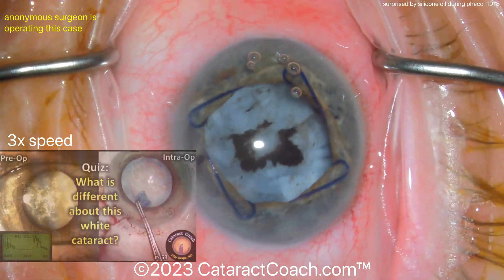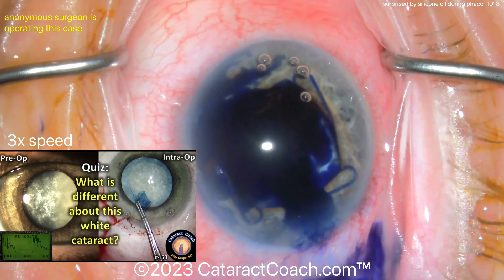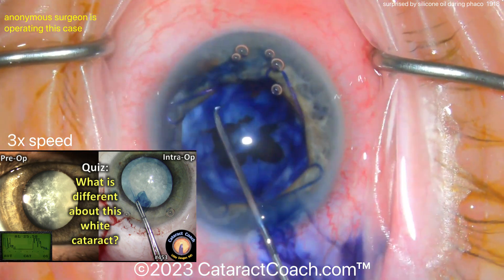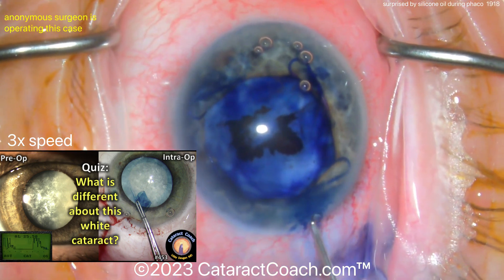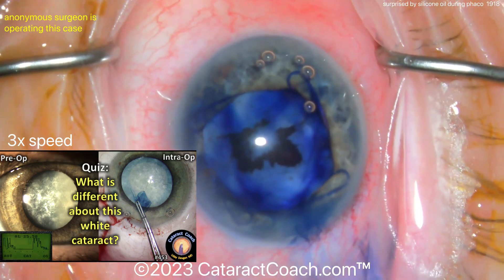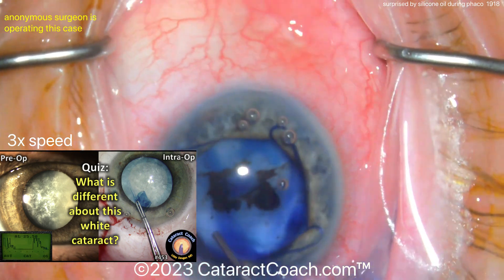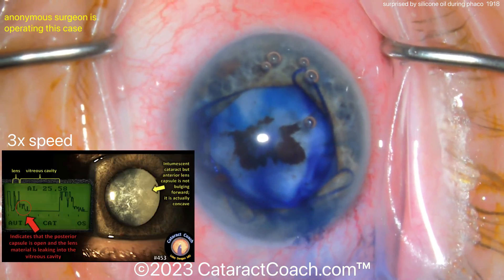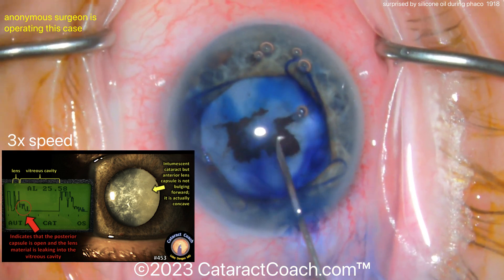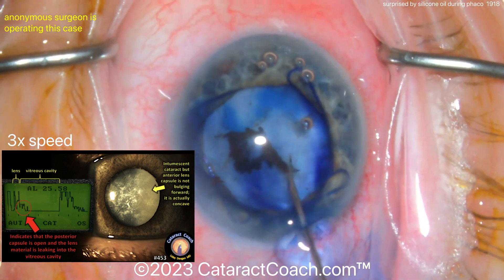Go back to old video number 453 from a few years ago. There was a quiz on what was different about this white cataract, and you can see the clue is on the A-scan — look at that inset picture. We'll put a link here. If you zoom in, you can see the posterior capsule is already open, and you can see that on the A-scan. That's an important clue.